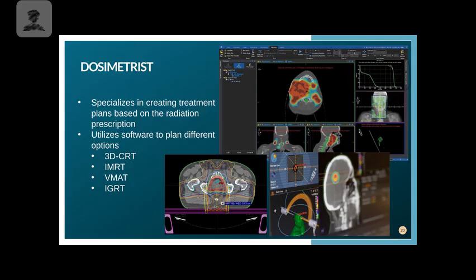You can see that down here as well for a brain cancer patient. It's actually showing you down here, as the beam is going through the patient, how much dose they would be getting as it's rotating around them. Here you can see where the volumes were drawn on the patient to indicate where that tumor is located, and then the areas surrounding that they're okay with there being dose delivered to.